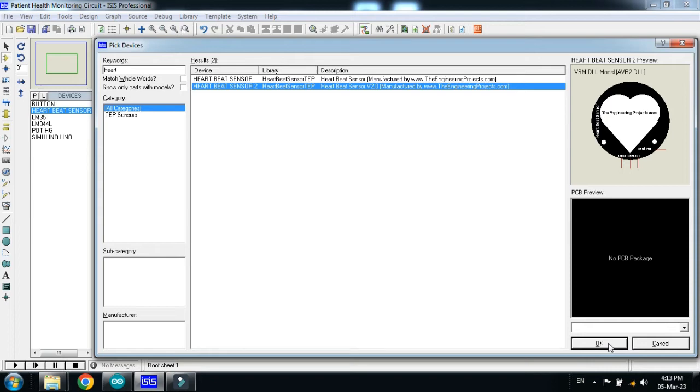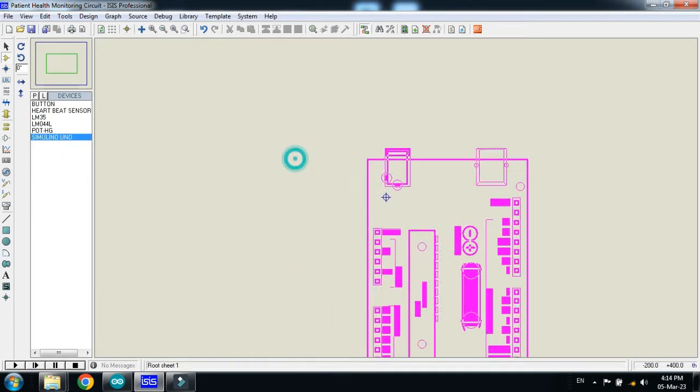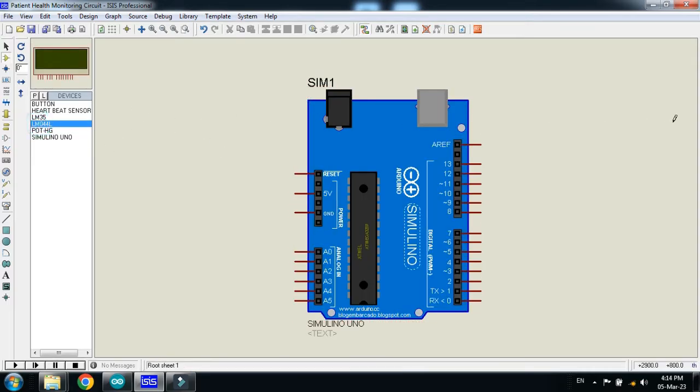Choose heartbeat sensor 2 — you have to choose the second one, which is heartbeat sensor 2, so double click on it. Now let's make the circuit. First of all choose the Arduino Uno and place it in Proteus. Now choose the LCD.